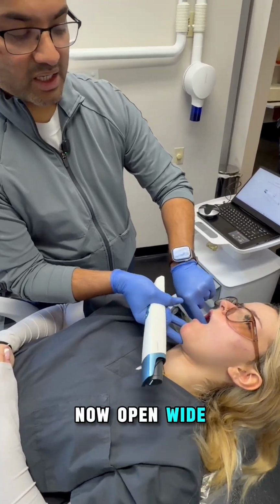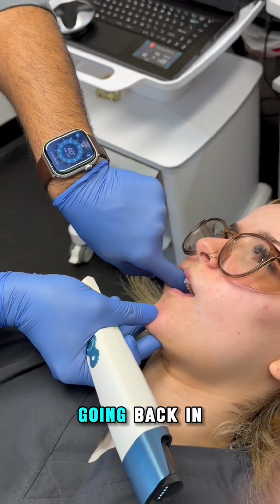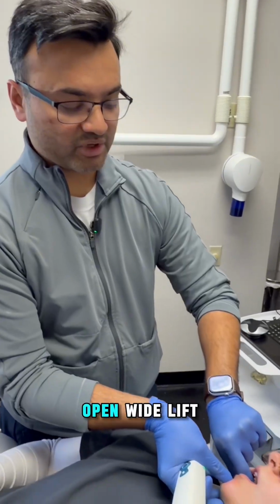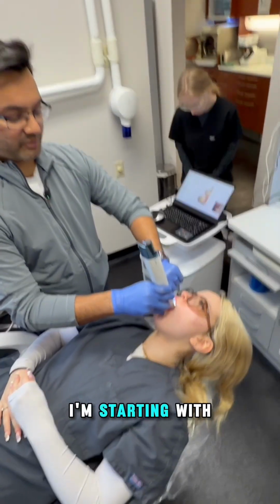Now open wide. I have no space, so I tell the patient, relax your jaw. While the patient relaxes, I'm feeling. Now I can see the mandible going back into the rest position, and you can automatically feel my finger going in. Open wide, lift your chin up again. So I'm not starting with the molar area. Again, I'm starting with the premolar.